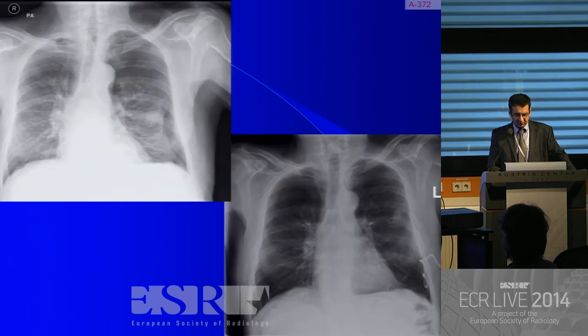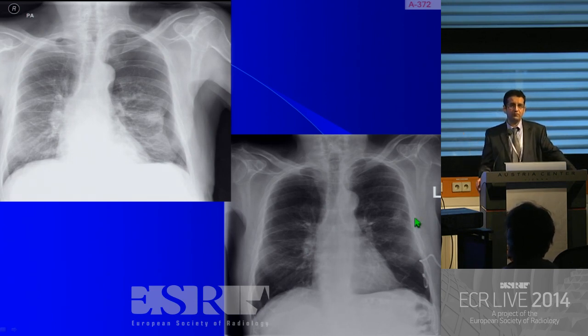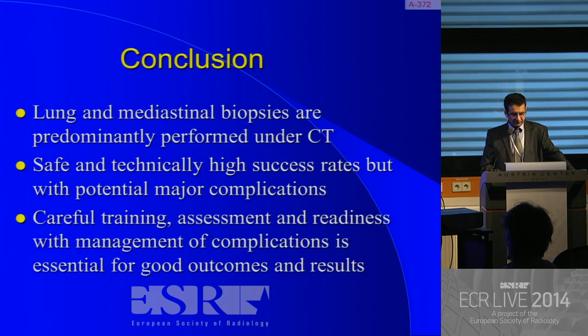Patient's fine, but in recovery, the patient, 4 hours prior to discharge, described some chest discomfort, pain, and a chest x-ray is done, and you can see a fairly significant pneumothorax there. And under Seldinger technique, we place the chest drain. This resolved 24 hours later. We kept this patient in and took the drain out afterwards.